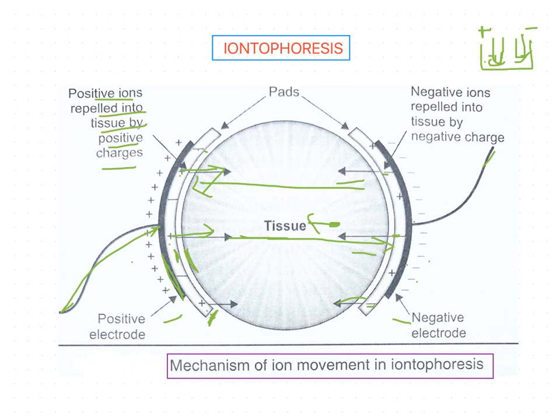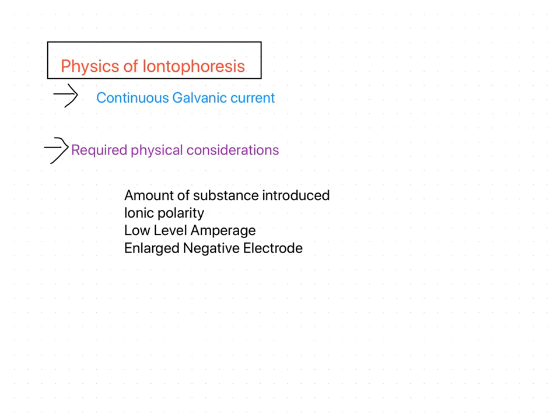Now we will see some of the physics related to iontophoresis.